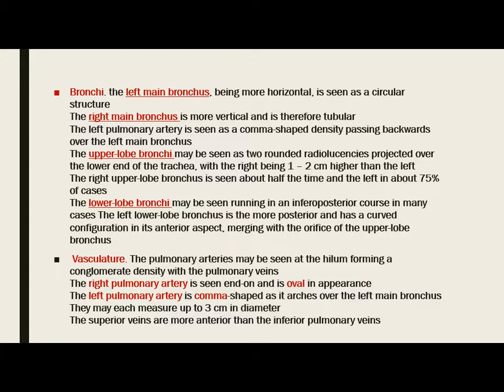The upper lobe bronchi may be seen as two rounded radiolucencies projected over the lower end of the trachea, with the right being one to two centimeters higher than the left. The right upper lobe bronchus is seen about 50% of the time, while the left is seen in about 75% of cases. The lower lobe bronchi may be seen running in an inferior posterior course. The left lower lobe bronchus is more posterior and has a curved configuration in its anterior aspect, merging with the orifice of the upper lobe bronchus.